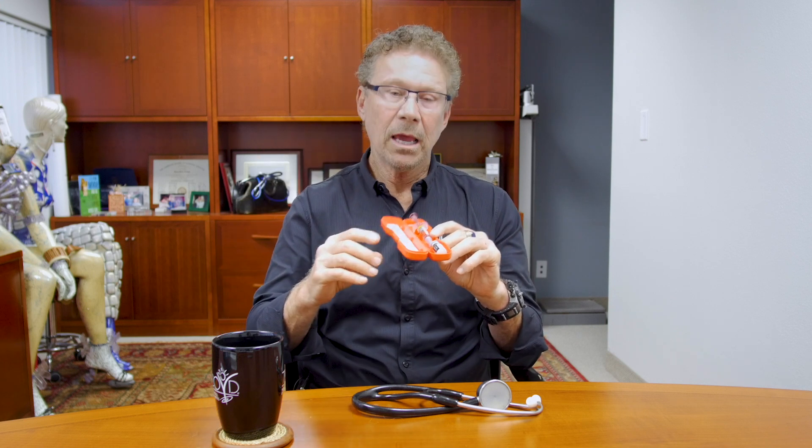Then you jab it in the individual's leg or their arm — any place. And don't worry, through their clothes, they won't even remember, even if they yell out "ouch." It works pretty quickly and you can bring them back to normal mentation very fast.